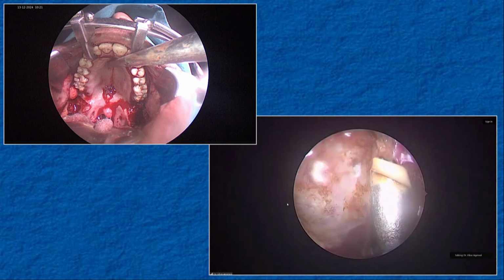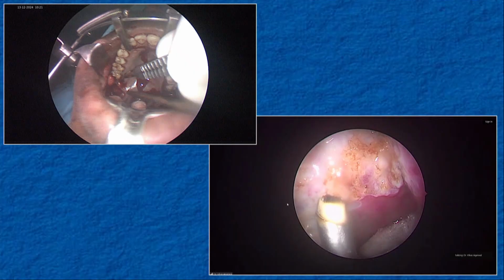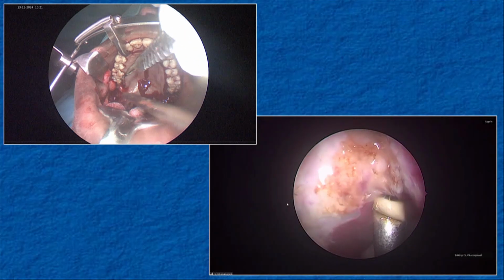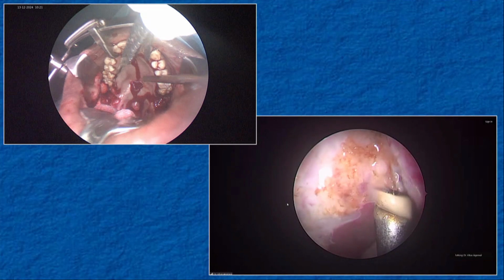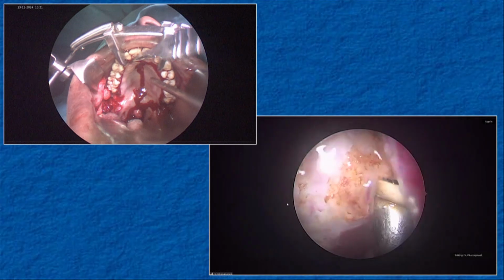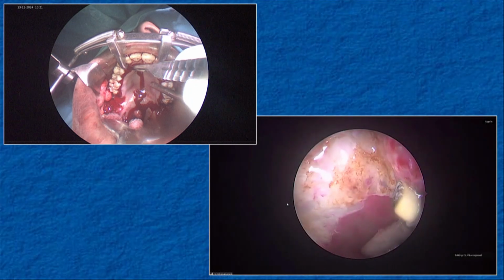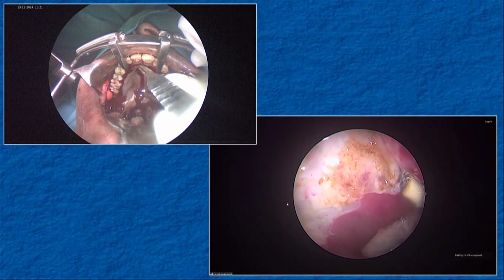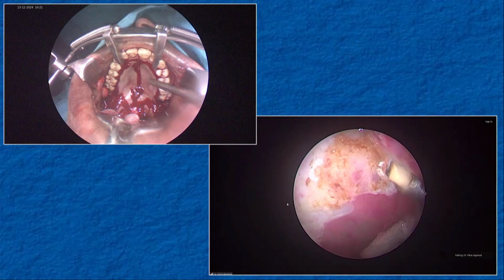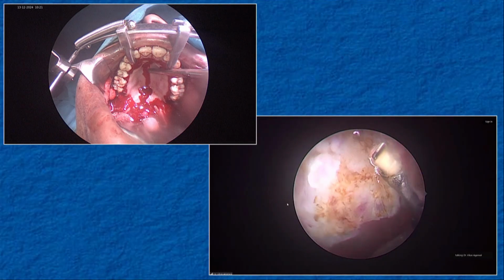You are absolutely correct. So see, this is the Passavant's ridge. Can you see that I have not got into the muscle? This is the last bit of tissue, and when you do it, can you see the contraction? So you have to be careful that you should not go into the muscles. If you are not sure, you can push it like this and then operate. See, if I have to take out this area, I am pushing it with the wand so that it does not come in my way. I have removed everything.